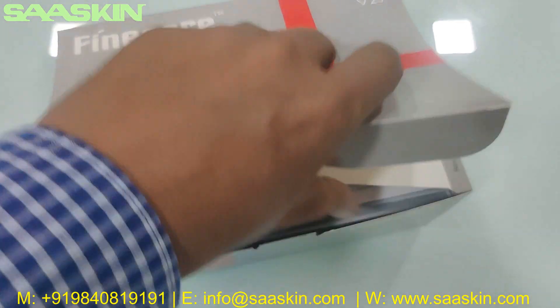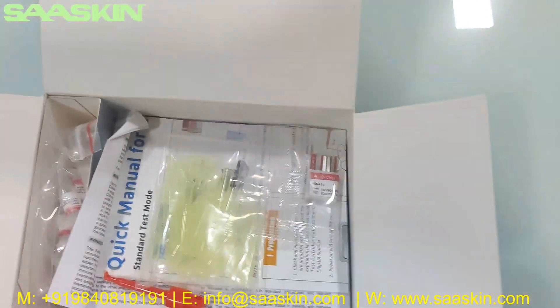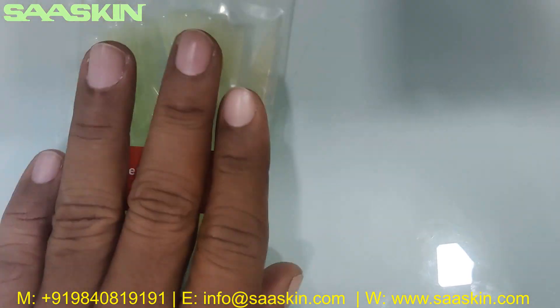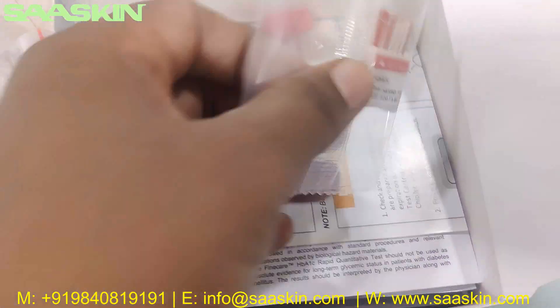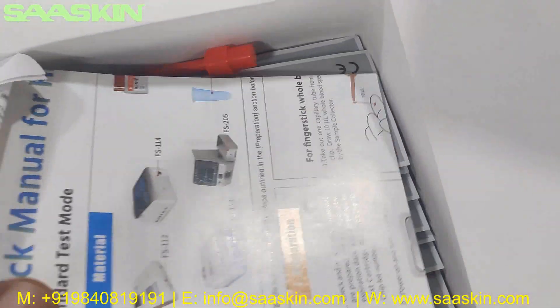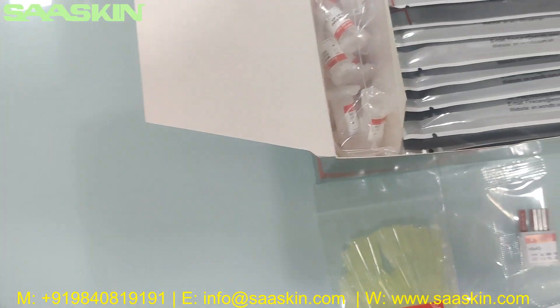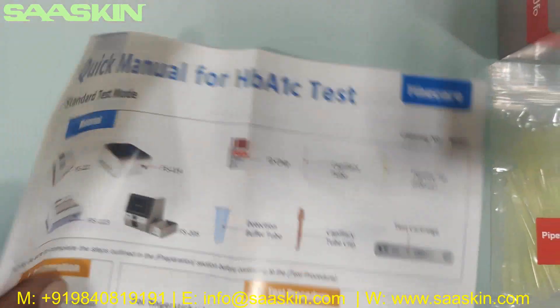I will just open this box for you. Inside the box you can see there are 25 pipette tips, and inside there is an ID chip. The ID chip code also has the reference to the lot numbers here. There is an ID chip and there is a quick manual — a quick manual for the HbA1c test.